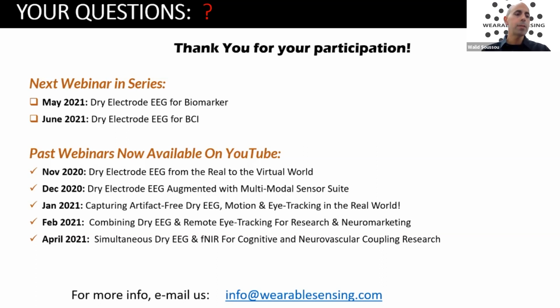Absolutely, they do come in contact with the scalp. The emitters are inside, but there's a conduit that brings the light to the surface, and that is making contact with the scalp through this spring loading mechanism. So the redundancy helps. If one of the emitters isn't making good contact, hopefully enough of the other ones are, so that you can get a good reliable signal through. If it's lifted up, either the emitter or the detector, you get a lot of leakage of light, and that can cause saturation on the amplifiers, which is why the tuning can then come in and shut that one down, as long as you have another one that's working well in that pod.